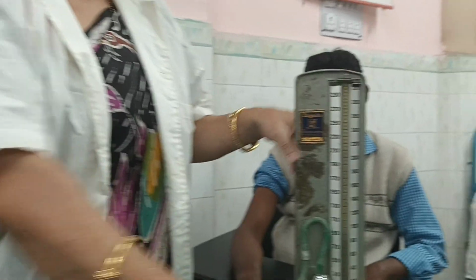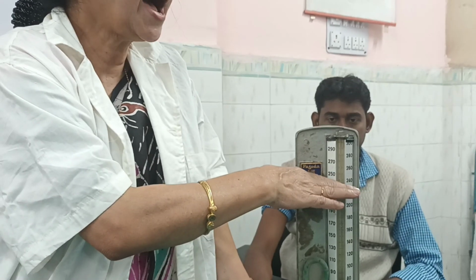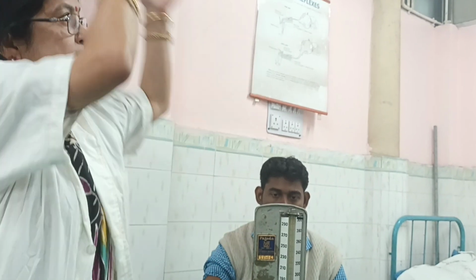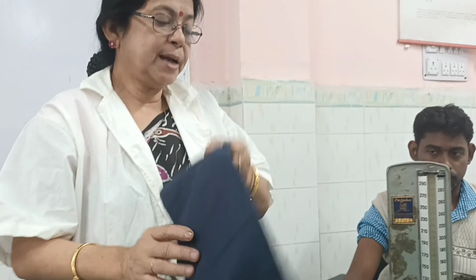And what is the position of the sphygmomanometer? The sphygmomanometer should always be at the level of the observer's eye, the examiner's eye, to avoid parallax error. You can place it high up or below, no matter, but there will be parallax error. So to avoid parallax error, the instrument should be at the level of the observer's eye and the cuff should always be at the level of the heart.